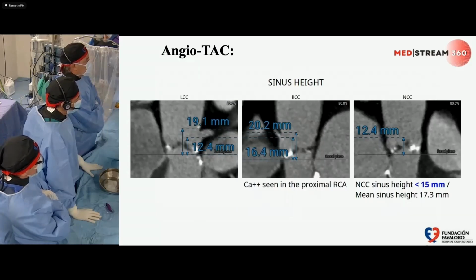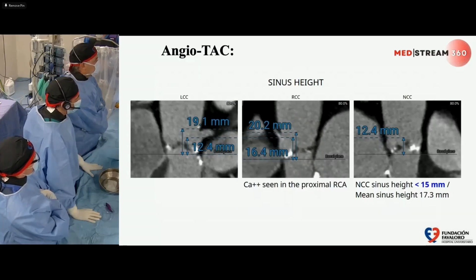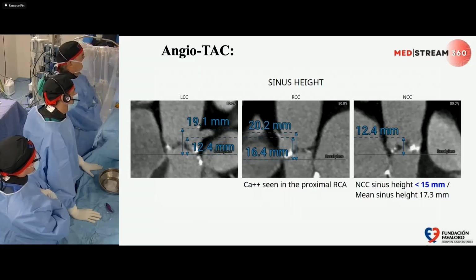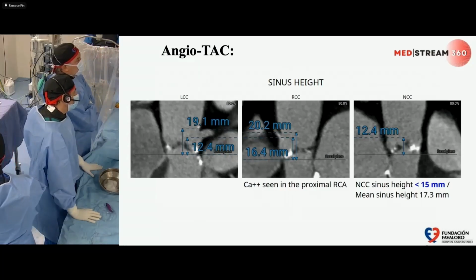Here we can observe the coronary height. For the left is 12 and for the right is 16, so it's something that we have to correct. The monitor is a little bit further than in the other room. Next.